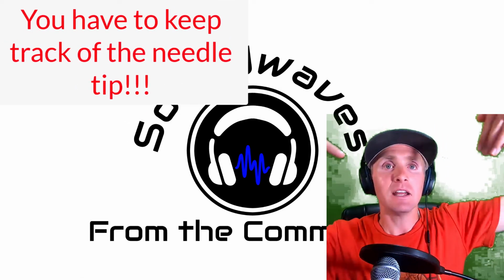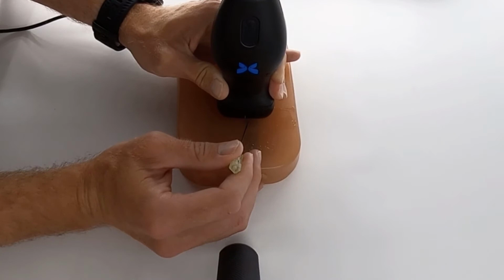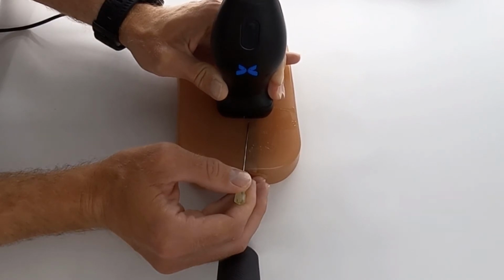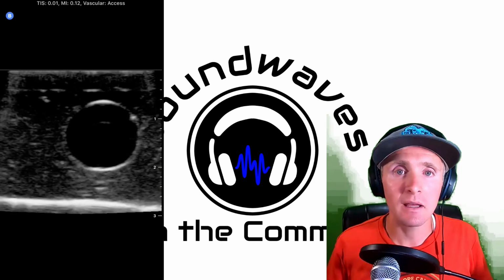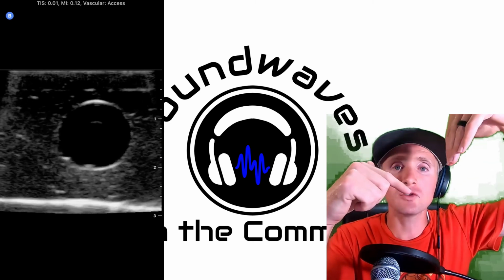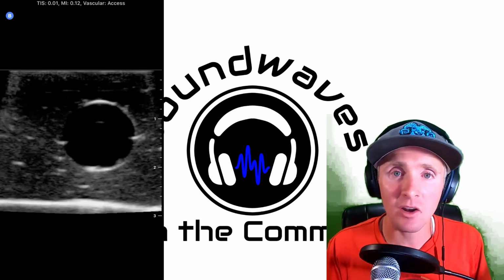The way you do that is, as soon as the needle tip hits that plane, you sweep the probe away from you, approximately up the patient's arm, just a couple of millimeters, a small sweep away. What's going to happen is you're going to see that hyperechoic dot disappear off the screen. So you want to see the hyperechoic dot, see the needle tip, stop moving the needle, move the probe away from you. Once you don't see the needle anymore, slowly advance your needle until you see that hyperechoic dot, that tip of the needle, come back into the sound wave plane.